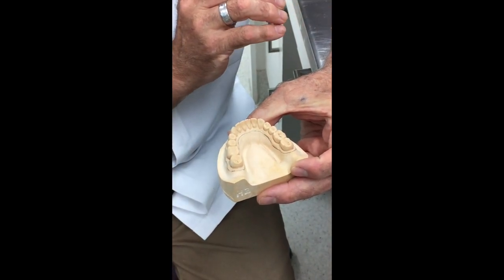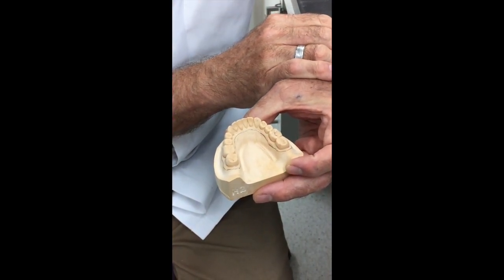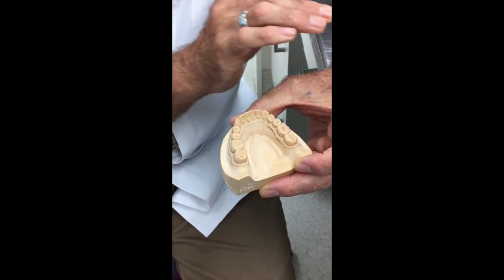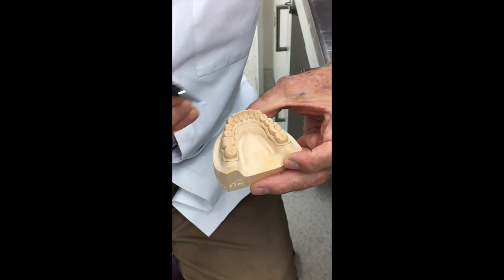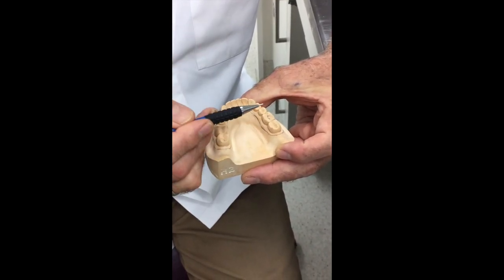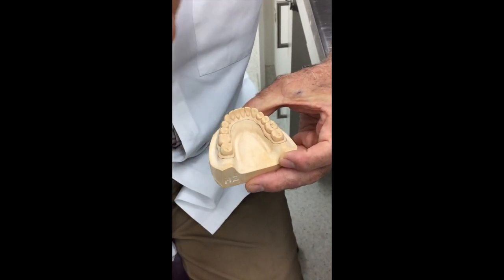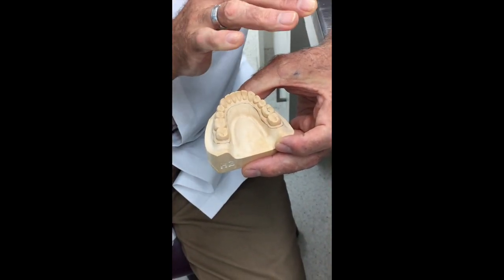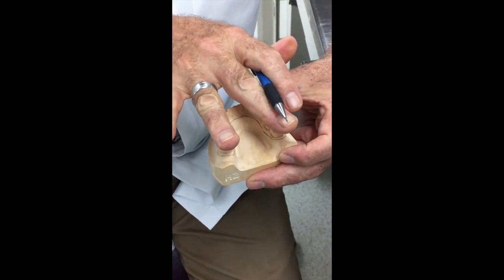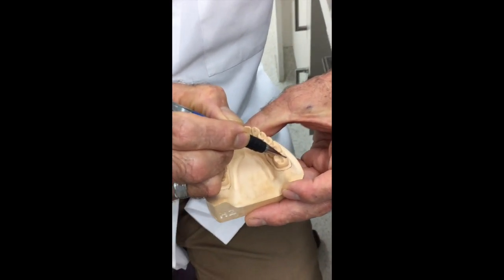Once we have done that, and before we place the spacer on, we're going to select where we're going to place our tissue stops, because we want a couple of areas where the tray is going to rest on teeth so that it maintains the space that we provide for the impression material. The general rule is that we're not going to place it where the prep is, because that tooth is going to be cut down, but we're going to place it in four spots in the arch that are wide apart and to the outside, so that the tray is seated positively and doesn't have rotation points. So we always go for four points here.